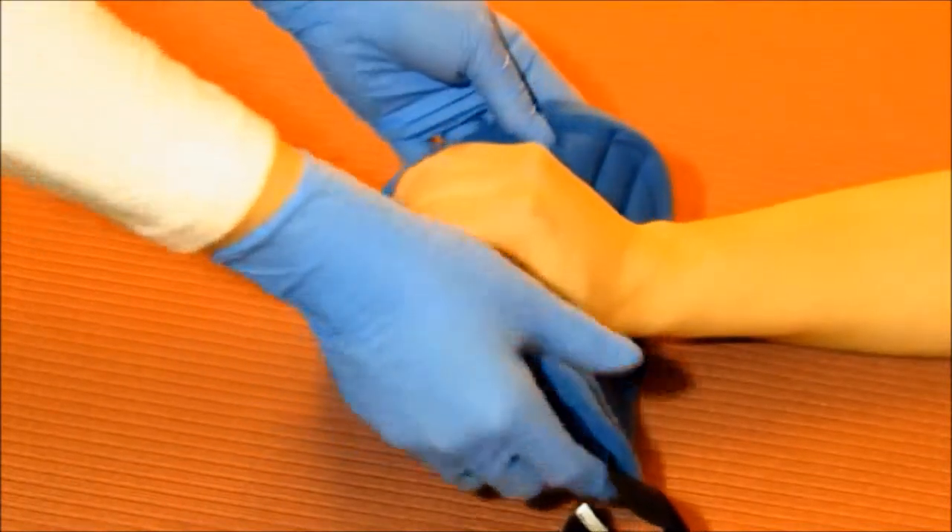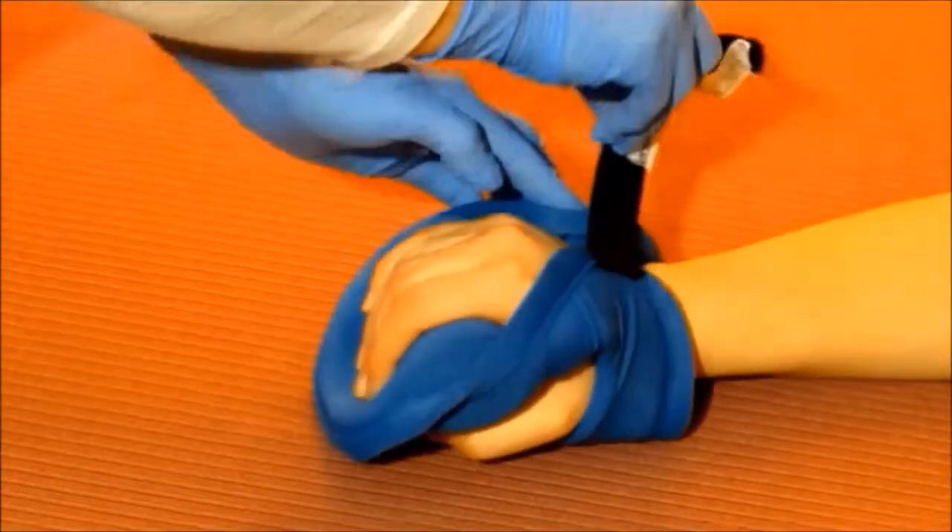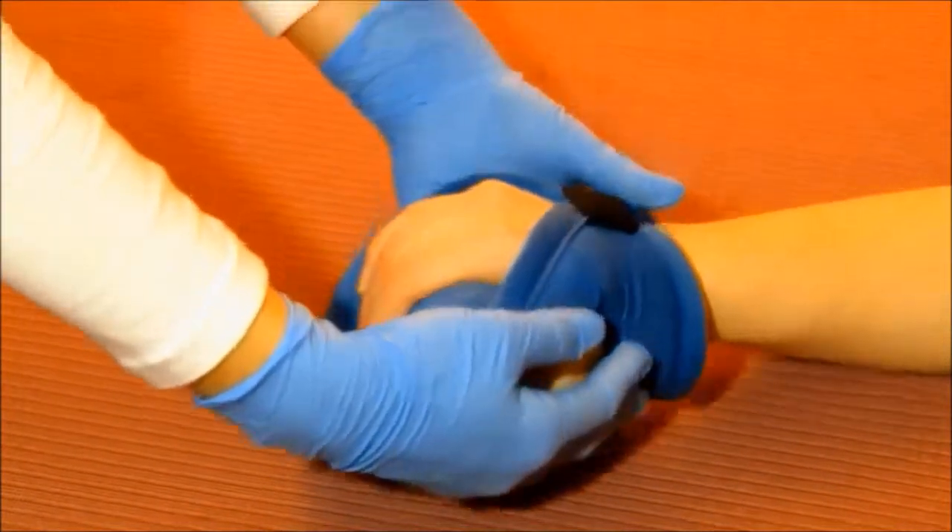Pull the adjustable strap across the back of the hand and secure the Velcro. Do not over tighten.